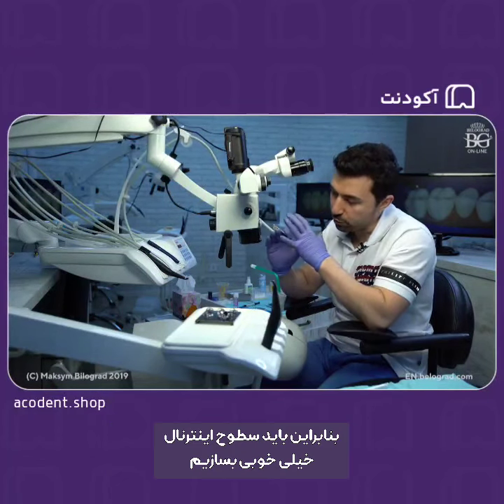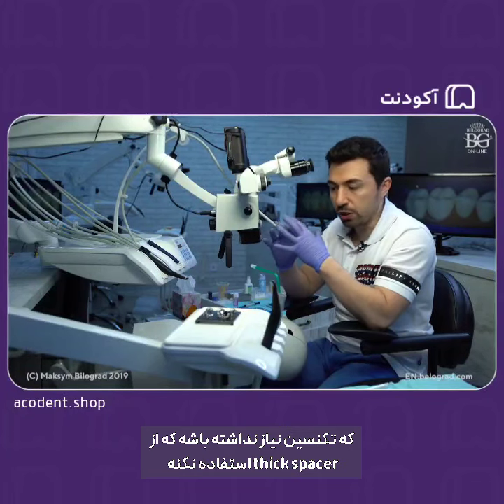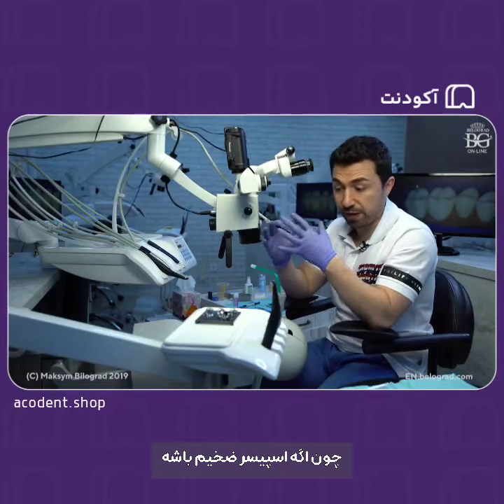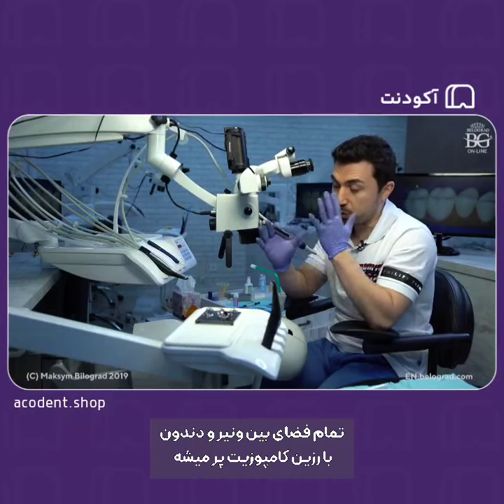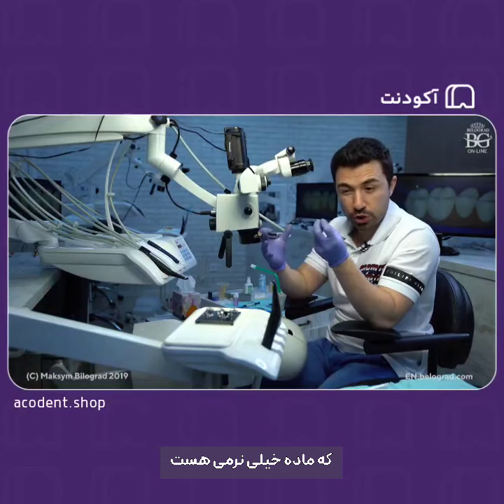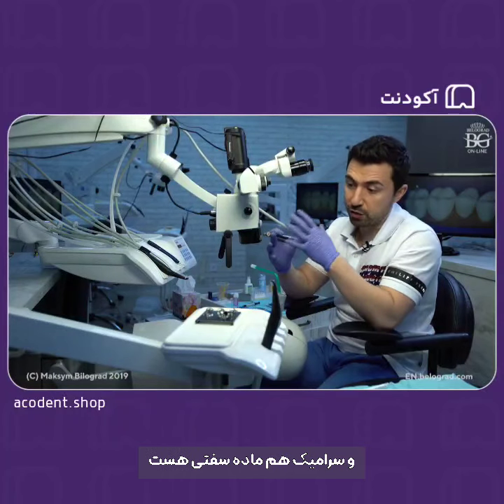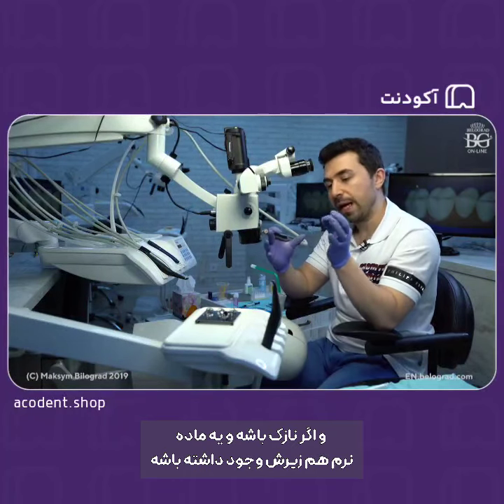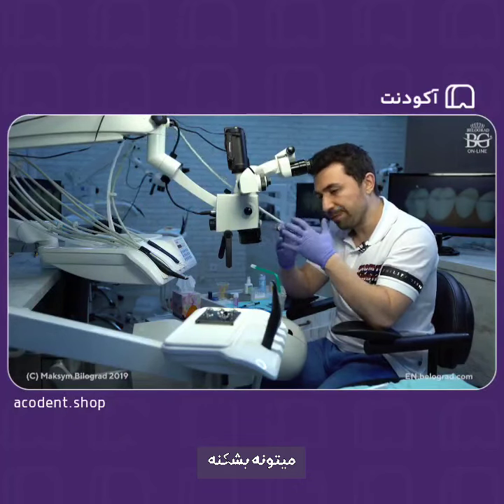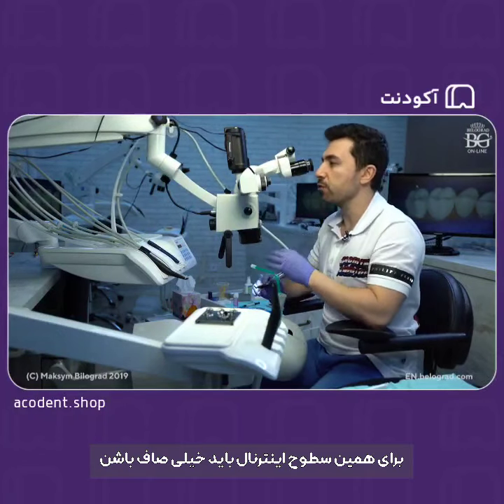Okay, so you have to make a really nice internal surface to give your dental technician conditions not to use thick spacer, because if the spacer would be thick, all this space between veneer and the tooth will be filled with composite resin, which is really thin substrate, very soft substrate, and ceramic being a rigid material, if it is thin and if it has something soft underneath, it can break. Okay, so that's why internal surface has to be really, really smooth.